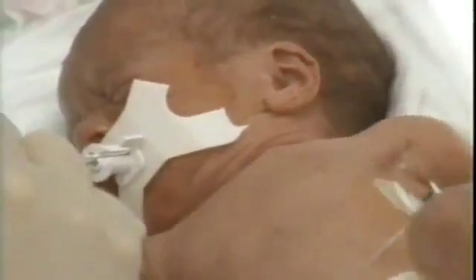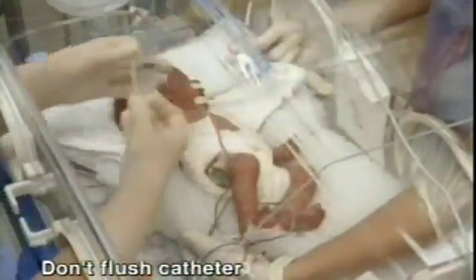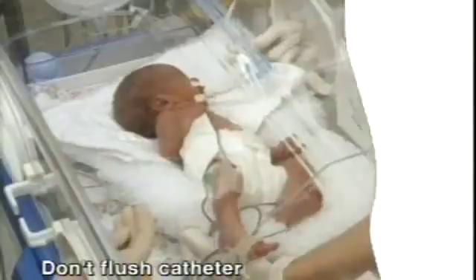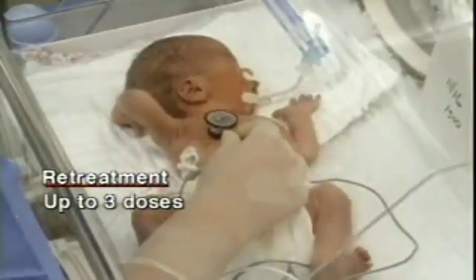Then, repeat the process for each of the remaining 3 fractional doses. Reposition the infant before each aliquot. When the final aliquot has been given, remove the catheter without flushing it and ventilate. If respiratory distress continues, up to 3 subsequent doses may be administered.